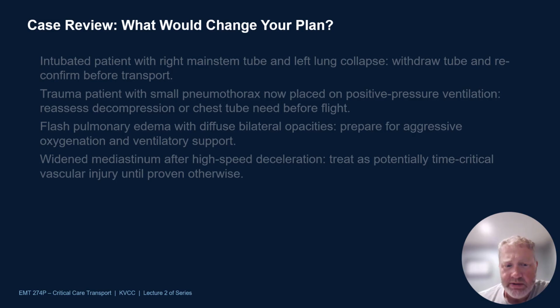A widened mediastinum, especially after a high-speed deceleration, after braking or landing if you're in air, that's a bad thing. Treat that as a potential time critical vascular injury, and get them to their destination as quickly as possible.